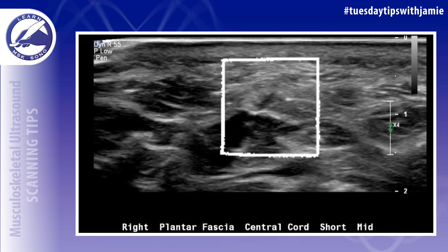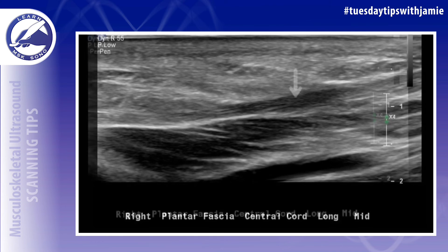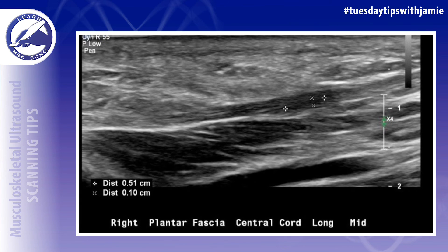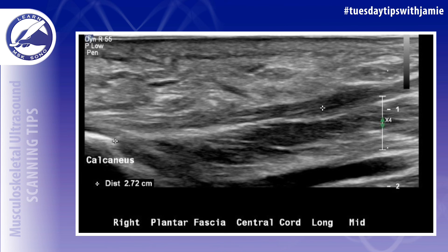Number four, there will be no vascularity present within the tear itself using PowerDoppler. In this example of the plantar fascia, the central cord initially only looked hypoechoic in the long axis, indicating focal plantar fasciitis. But there was a tiny partial thickness tear present that did not stand out until these techniques were utilized. I hope this tip helped.